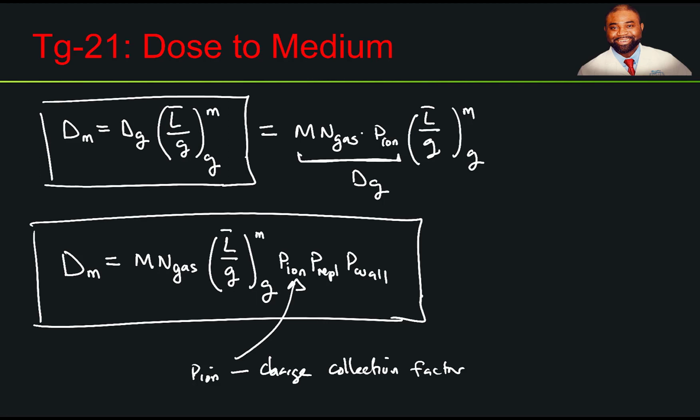The next calibration factor that I'd like to talk about is P wall.